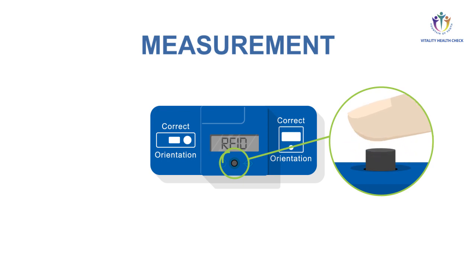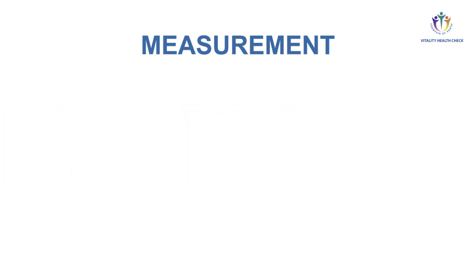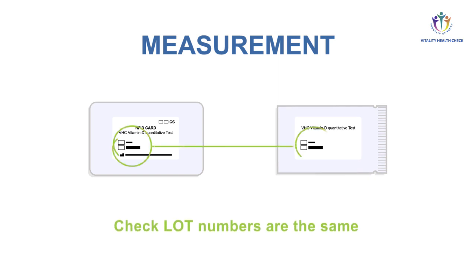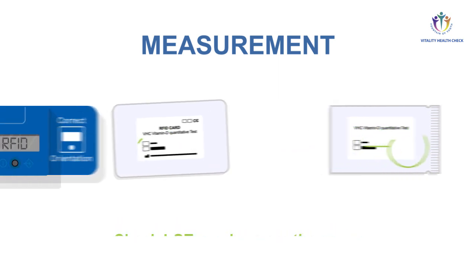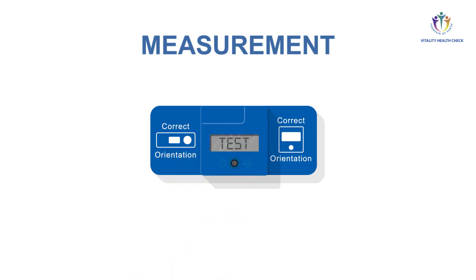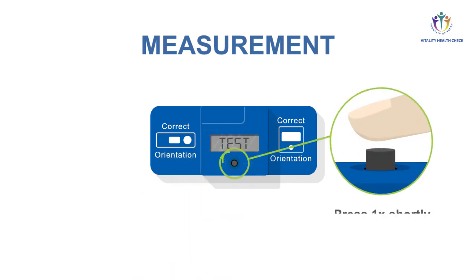Timer mode can now be activated by pressing the button long until the display switches and shows RFID. Verify the lot numbers of the test packaging and the RFID card are the same. Place the RFID card on top of the VHC reader. A beep tone confirms the data transfer is completed. The display will show test. Press the button again.